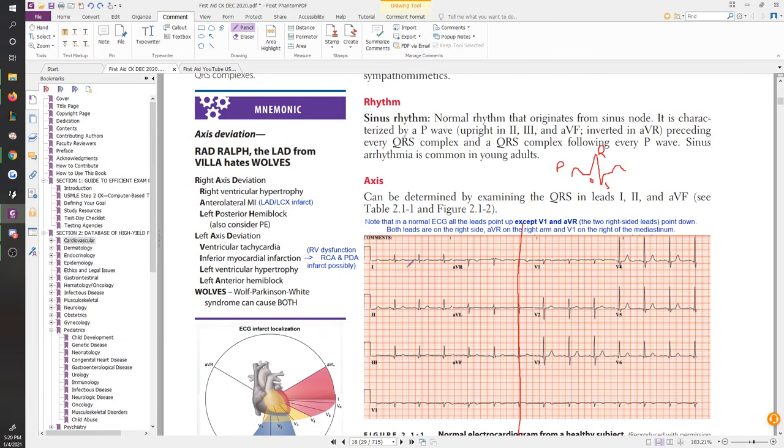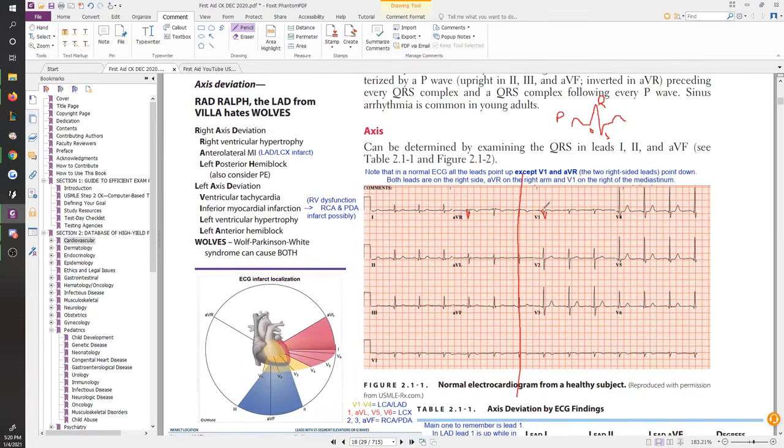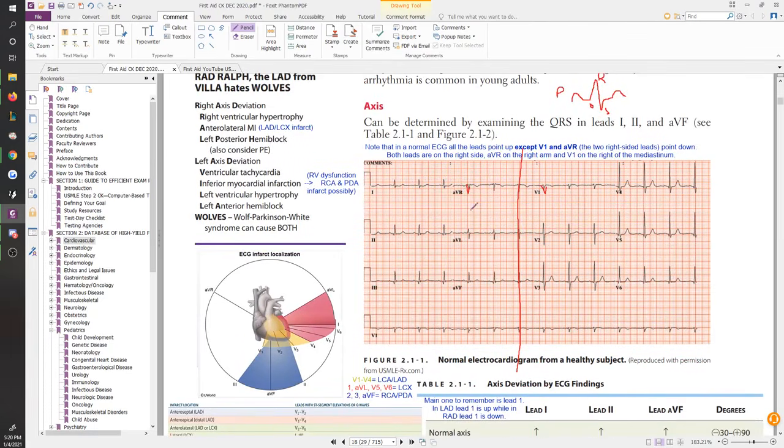And so there's a reason why lines go up, and then you can see where things are going down, actually, right? You can see in AVR, the whole QRS is pointing downwards. In V1, it's all pointing downwards. And then everywhere else is pretty much either equiphasic or pointing upwards. So AVR and V1, the clear, obvious thing that's pretty unique about them is the fact that they're on the right side. Okay, AVR and V1 are on the right side.